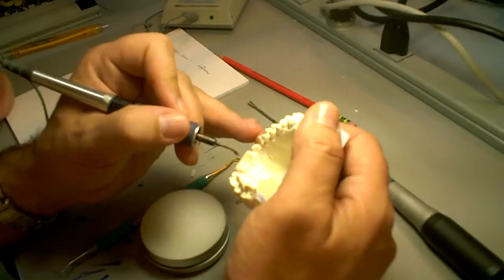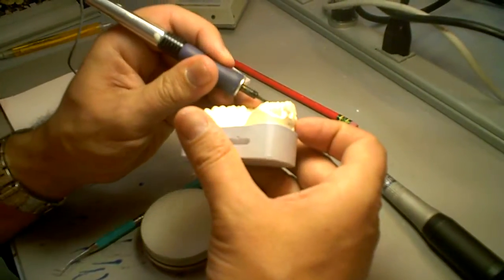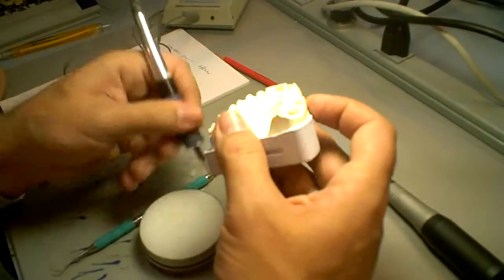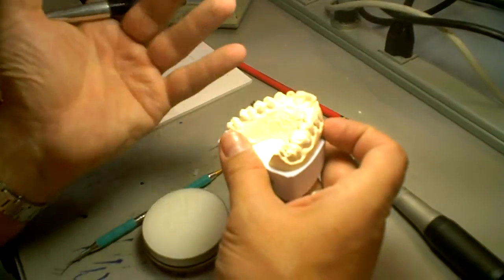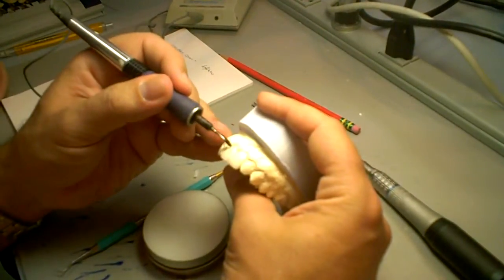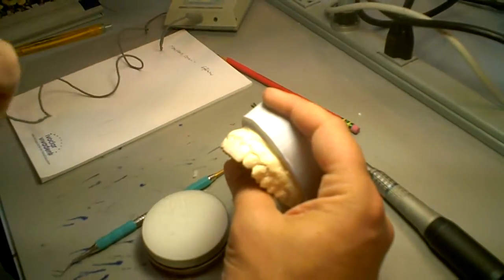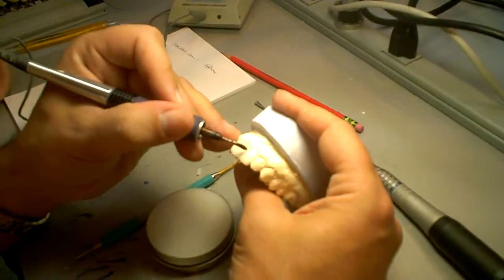If you want to leave it like that, it's fine. You're saying not wrap it because of the draw, but composite. You can do that. Or you can just prep more aggressive so then you can have a nice lingual, so the patient feels more comfortable. With my veneers, I don't have that. So I have one that is a little bit wider than the other. And the tongue kind of gets used to it after a couple of decades.